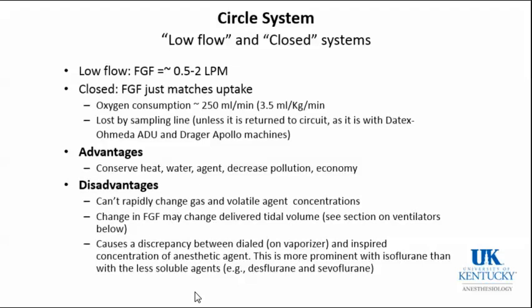When you change the fresh gas flow, it may at least temporarily change tidal volume. And finally, it causes a discrepancy between what you're dialing in to go to the patient and what the patient is actually getting. Because remember, what the patient is actually getting is a combination of what's in the fresh gas flow that you're delivering and how much is in the expired gas which is being mixed with it.